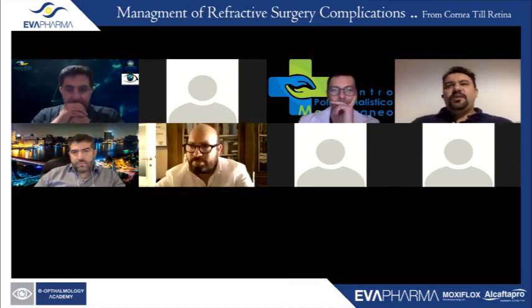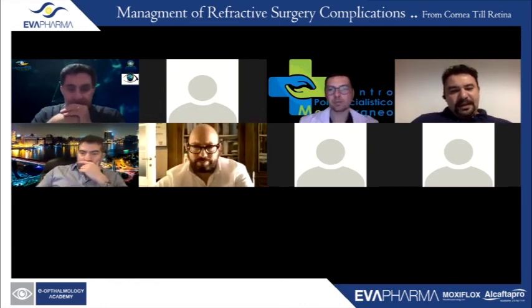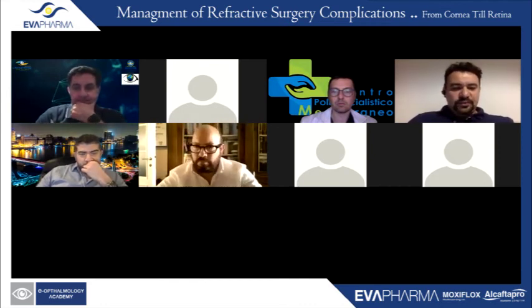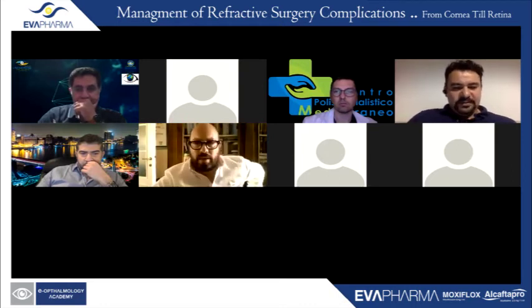Yeah, I totally agree with you, but using confocal microscopy preoperatively for LASIK or refractive surgery cases would be a burden for the patient and for the surgeon, because it's not available everywhere. But of course, if we have a confocal microscope, it would be nice to detect things like this preoperatively. For example, if we are talking about another issue like ectasia, we would like to have seen the confocal microscopy preoperatively for every patient. But this is not available everywhere. I think in Egypt it's available in just one place.